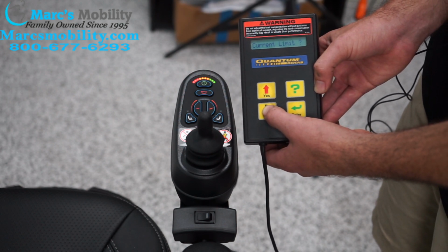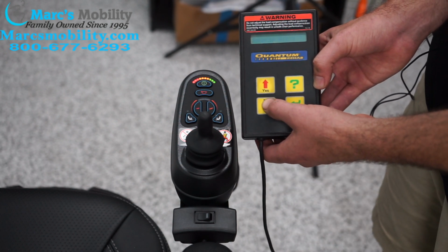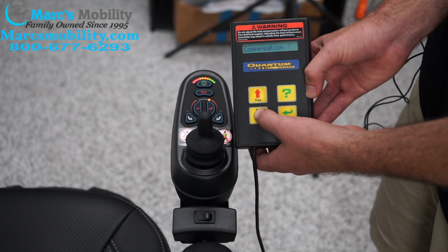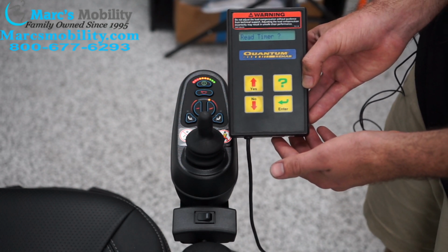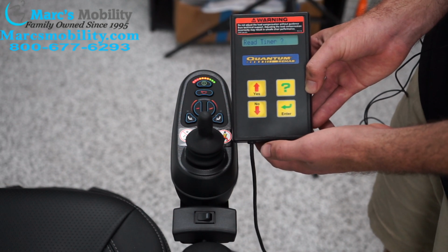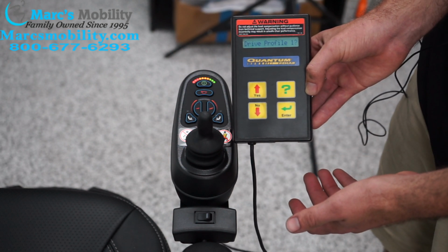I'm going to skip some of these. They're not relevant to programming your chair. Reverse alarm is, you can set an alarm for when you're backing up the chair. Don't need these. So read timer, if you want to see how many hours are on your chair, you can select read timer. If I hit enter, this is a new chair that has 0 hours. I hit enter again, I go back to the main menu. Don't need that, don't need that. And now we're back to drive profile 1.